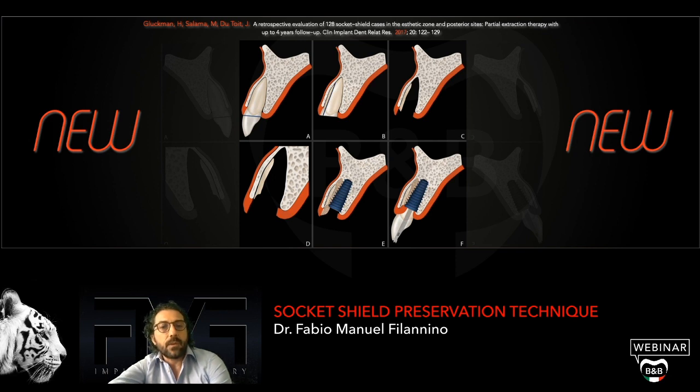We were confronting each other about this technique, and I had already heard about it, but at that time it was really time zero for me, because for the first time I had from one of the authors of this article the first indications and protocols about the technique: how to cut the root, how deep to cut the root, what width of shield we have to maintain, what the correct insertion of the implant is, and the prosthetic considerations about this technique.